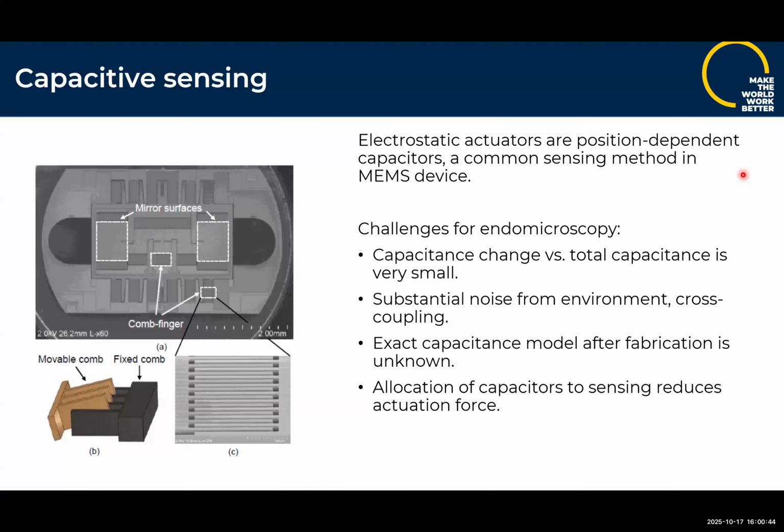And there's another phenomenon that is really widely encountered in microsystems, which is called feedthrough. You're driving this actuator at a given voltage. That's capacitively coupled to the sensor just purely electronically. So most of the signal you're often getting out is the coupled driving signal, not anything related to the actual motion. These are widely known problems in MEMS engineering. There are just a few twists on these that come into play for our endoscopy application, and I'll talk about how we deal with them.